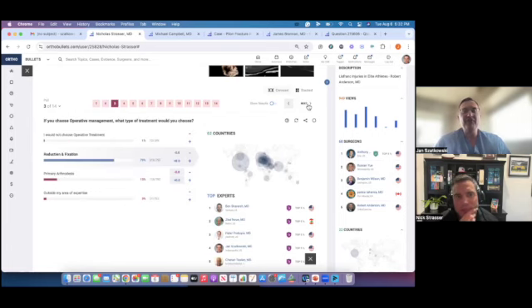All right. So here, if you choose operative fixation or operative management, what type of treatment would you choose? So I love this question. This is awesome. Reduction fixation versus primary fusion.